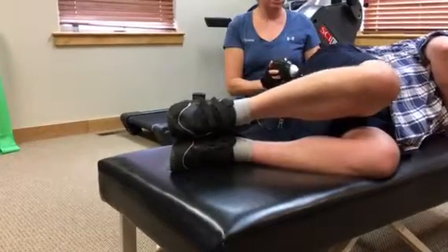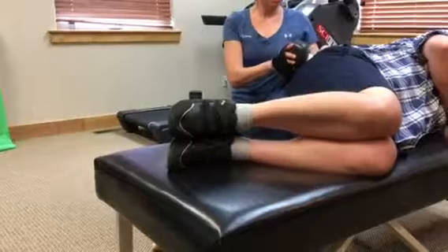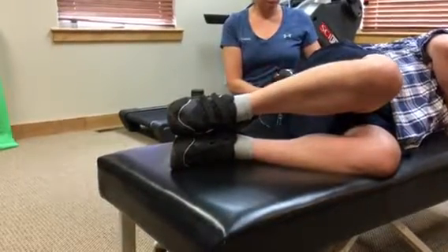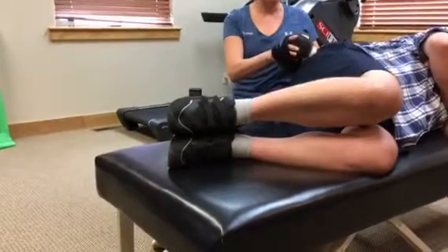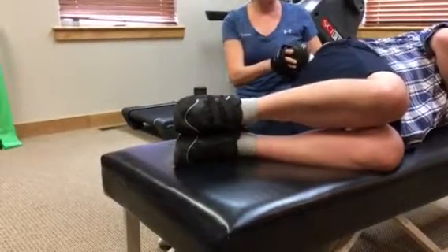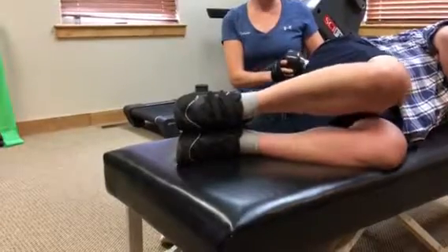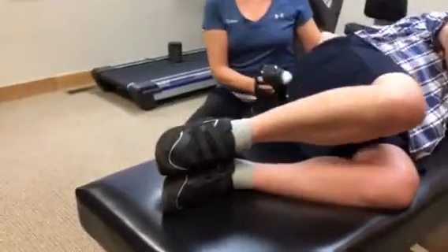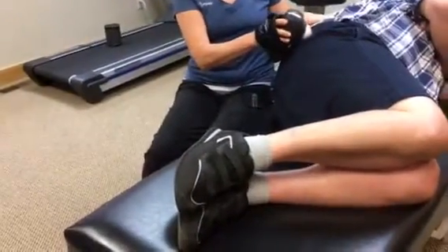Go ahead and lift, then let it back down. Go ahead and lift again. And the more input I give him, you can see how he gains more range of motion with every repetition. Go ahead again. We'll go one more.